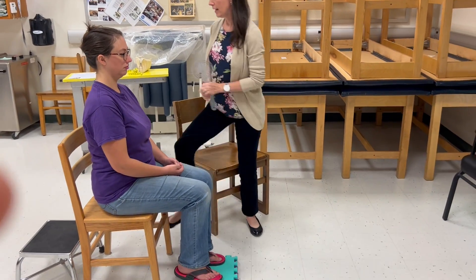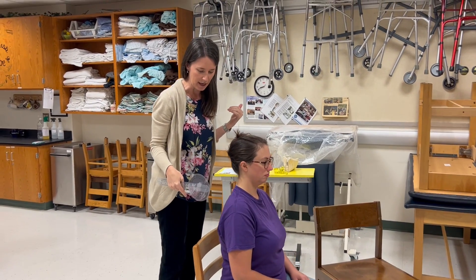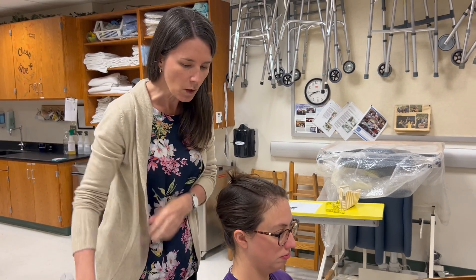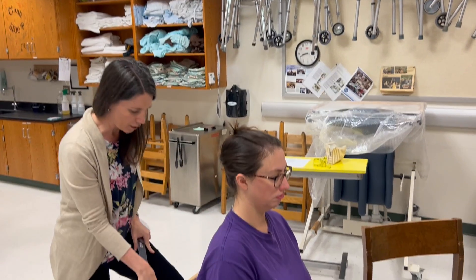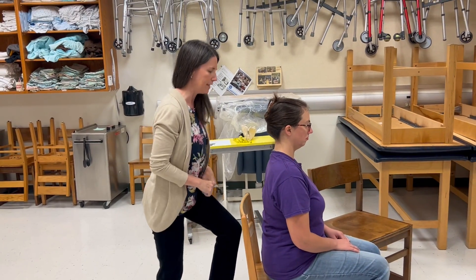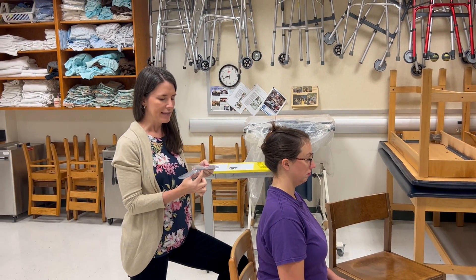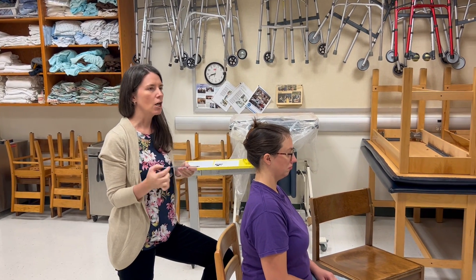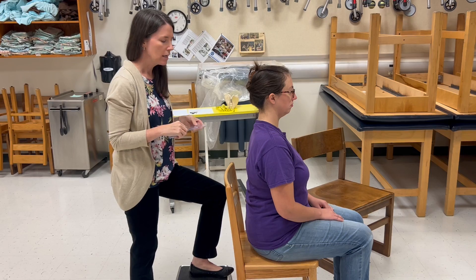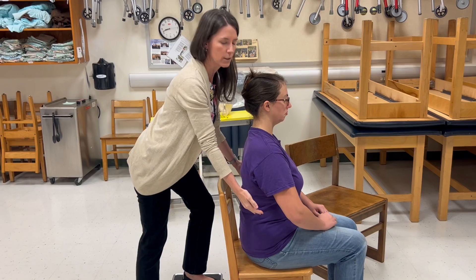To measure this, the therapist is going to stand behind the patient. Depending on the height of the patient and therapist, you might need to stand on a stool because you need to be able to look directly down at your patient. The fulcrum goes over the center of the cranial aspect of the head, and the stationary arm is going to be parallel to the line that connects the two iliac crests — though palpating the iliac crests and determining what's parallel to that line can be quite challenging.